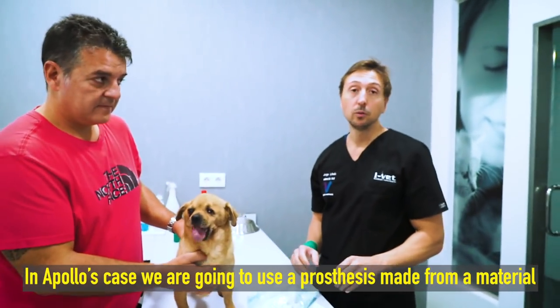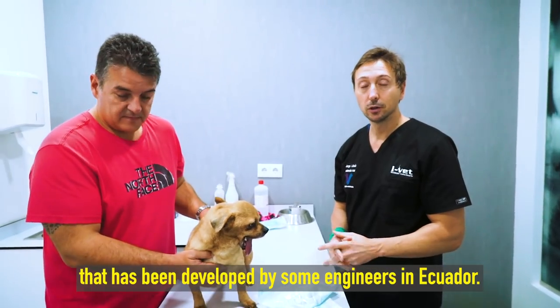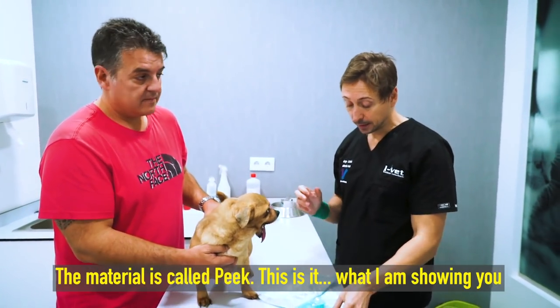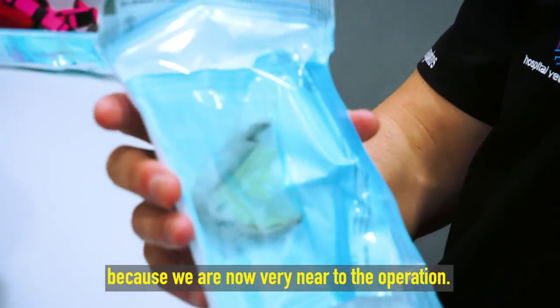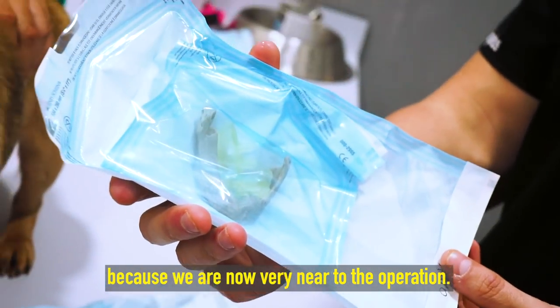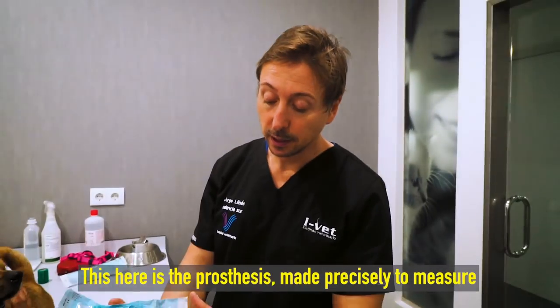En el caso de Apolo, vamos a poner una prótesis de un material que han desarrollado unos compañeros ingenieros en Ecuador. El material se llama PIC — es esto de aquí que os enseño. Como estamos ya muy cerca de la operación, lo hemos esterilizado con un sistema especial de óxido de etileno.